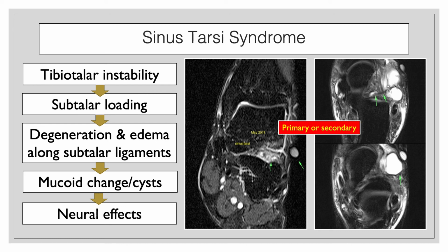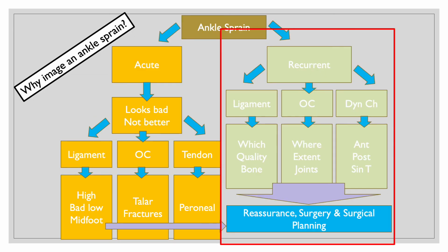So in patients with a more chronic ankle injury situation, we are trying to determine which ligaments are involved, what is the quality of ligament involvement, and what is the quality of the bone. We're also trying to determine osteochondral lesions, how big they are, whether they're stable or unstable, and the extent of cartilage damage. Should somebody get an OATS procedure, microfractures, should somebody get an ankle fusion.